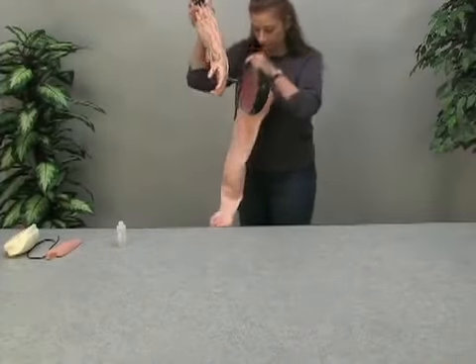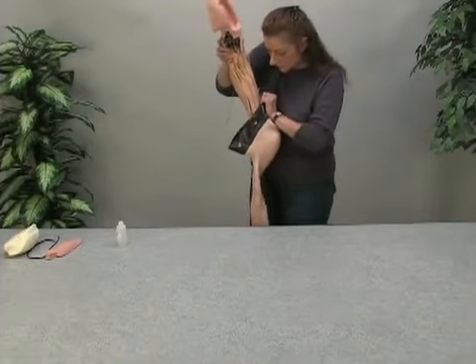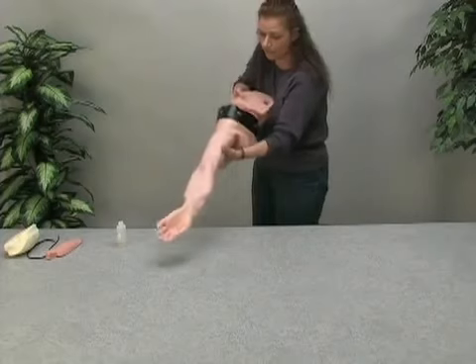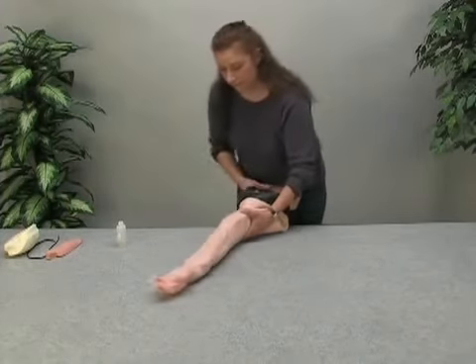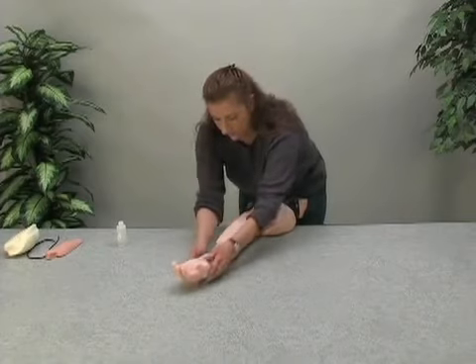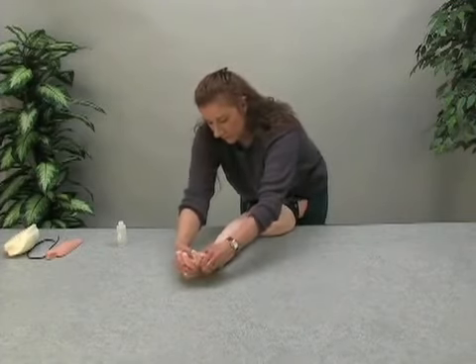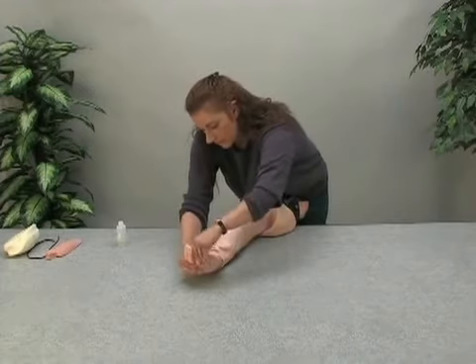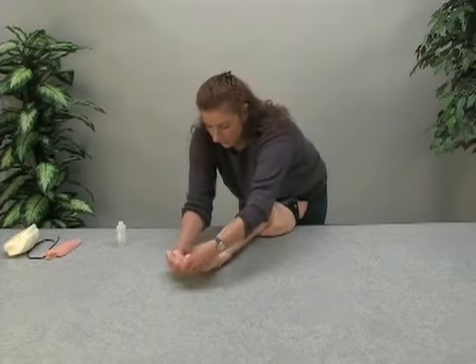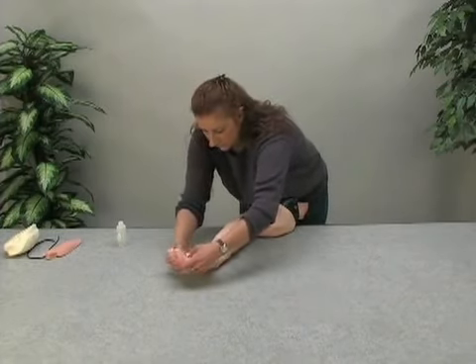Grasping the skin with one hand, gently slide the arm into the skin until the fingers approach the finger holes. It is important that the hand and shoulder are aligned properly and the veins have remained inside the vein channels. Carefully work the fingers in the proper finger holes. If air has been trapped between the skin and hand, work it out gently.